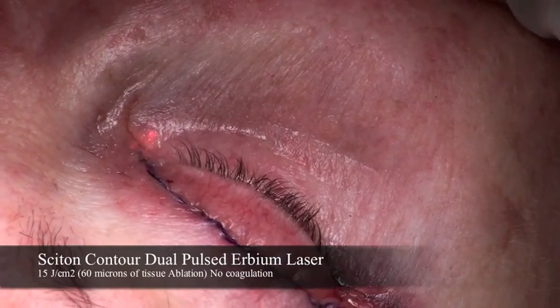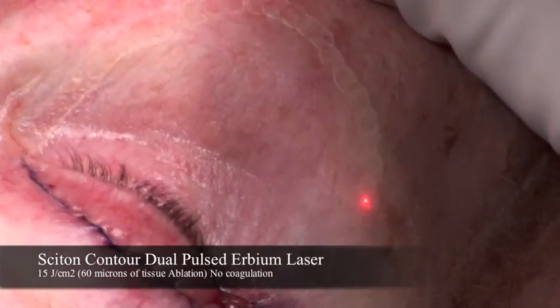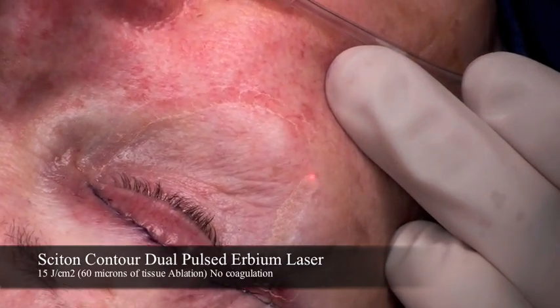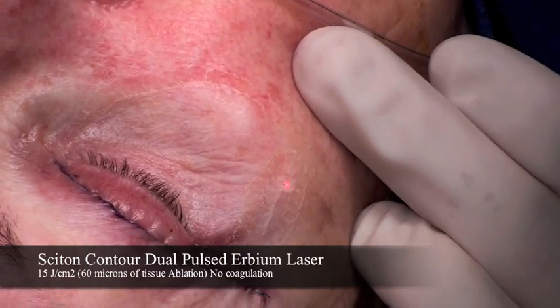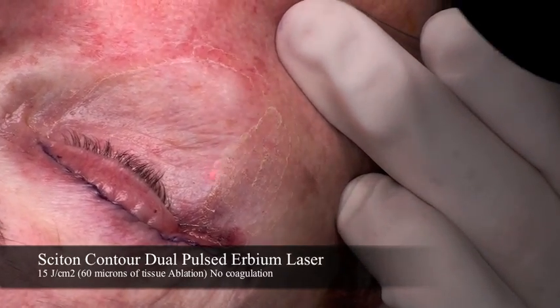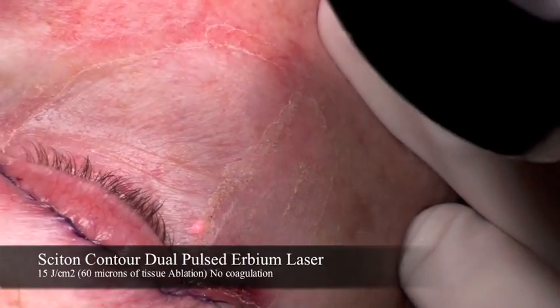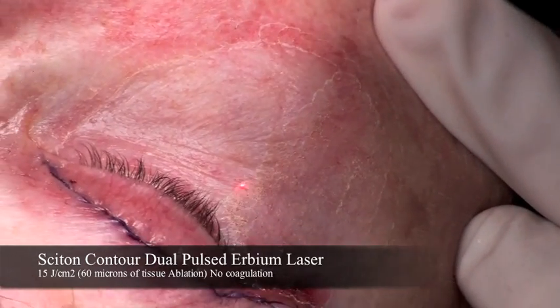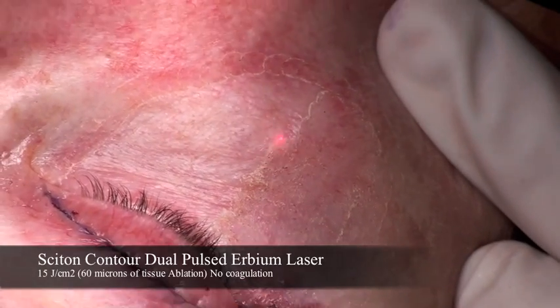For this first application of the laser, we set the laser at 15 joules per centimeter squared. This ablates about 60 microns of tissue. In this first pass, what we try to do is remove most of the epidermis. The subsequent passes will put in subablative energy that will cause even more tissue tightening. I'm using this laser in a freehand fashion with a 4 millimeter spot size and approximately 50% overlap. This creates double the fluence in the treated area.